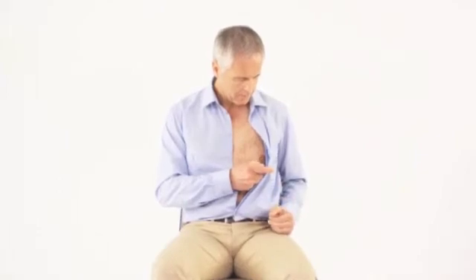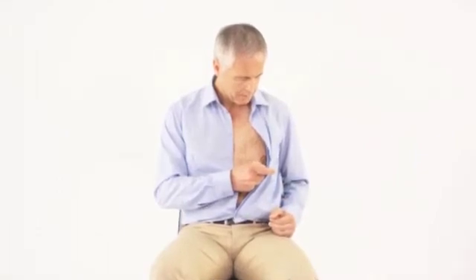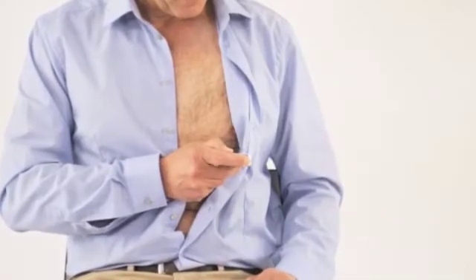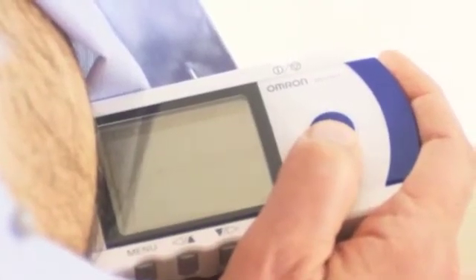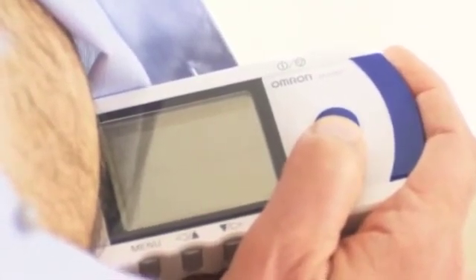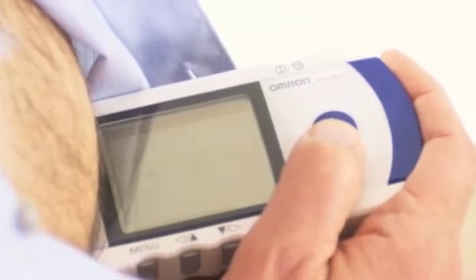Press the start button to start the measurement. Now the patient should be still and not move. In about 30 seconds, you'll hear four rapid beeps. The measurement ends automatically.